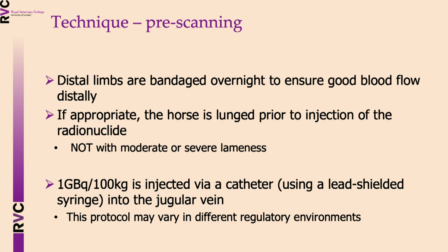We use a lead-shielded syringe to minimize exposure to personnel, but this protocol can vary depending on the regulatory environment. So I'm unsure what it is in this country.